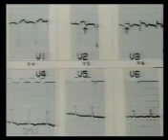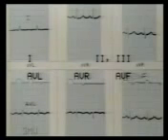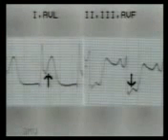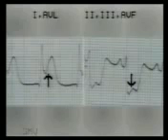The limb leads may not show any changes in a small anterior septal infarct — here there is minimal ST elevation only in AVL. In this ECG, note the marked ST segment depression in inferior wall leads 2, 3, and AVF. The ST segment is depressed by up to 10 mm. There is ST elevation in AVL with tall T waves in leads 1 and AVL — this is a very fresh anterior wall infarct. More the amplitude of ST elevations and depression, more is the severity of the infarct.